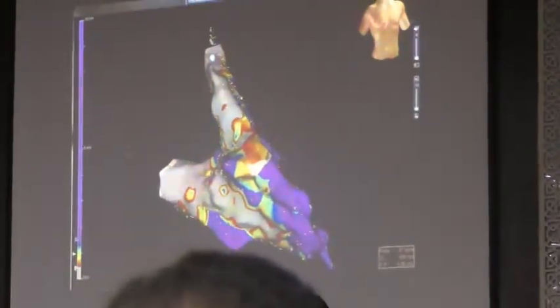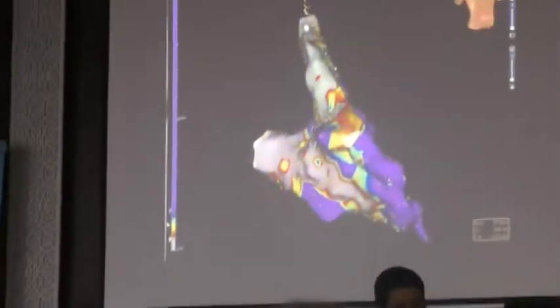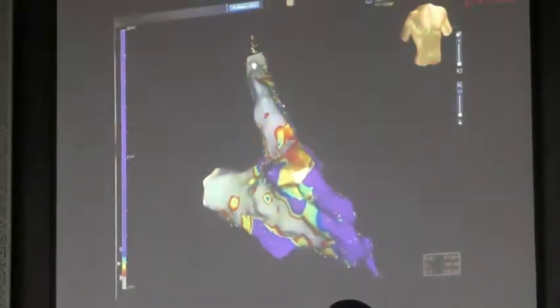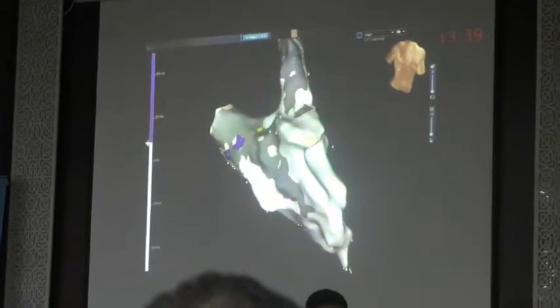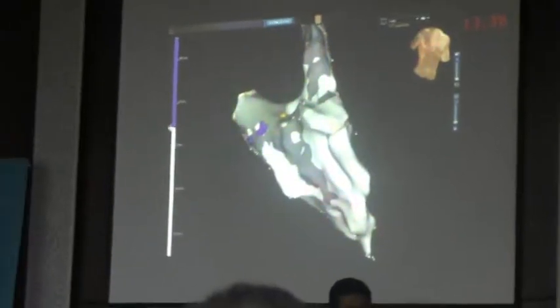So the patient was taken to the electrophysiology lab, and we started with sinus rhythm voltage mapping to identify the substrate. And we believe that late potential is the most important part of this, especially the data from late potential at sinus rhythm is extremely important, because late potentials are actually the electrical substrate of ventricular tachycardia.